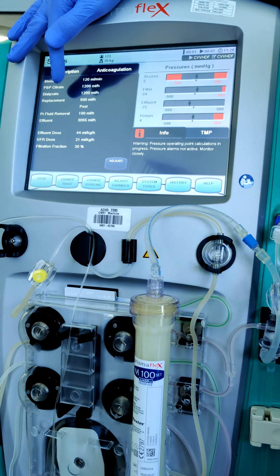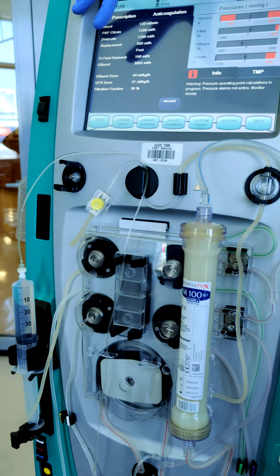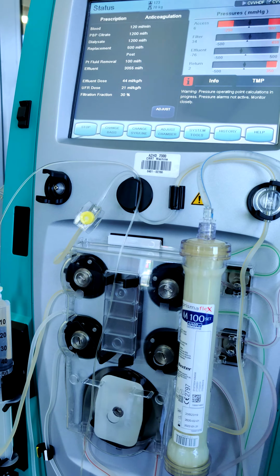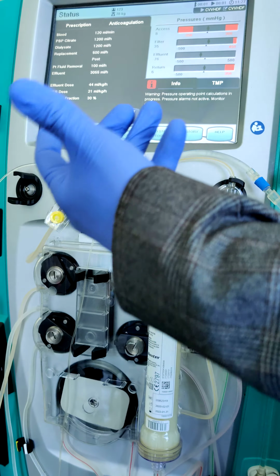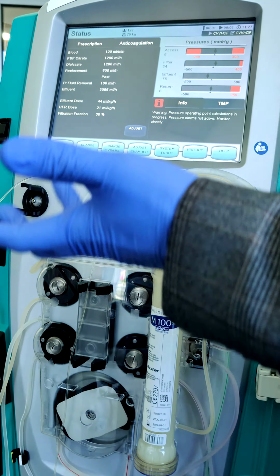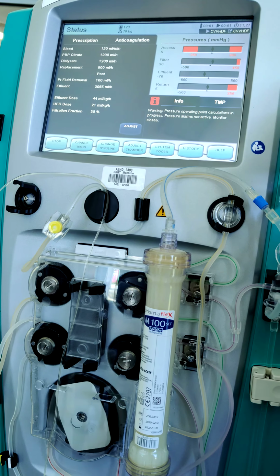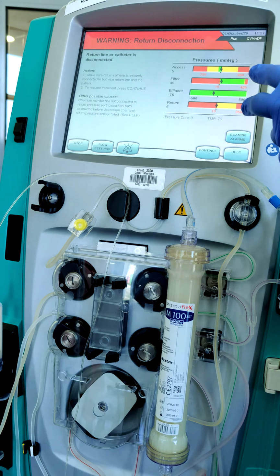The dialysate is calcium free, but the replacement is with calcium, with other composition. So if I'm increasing the replacement, that means I'm increasing the calcium. If you decrease the dialysate, you will decrease the bicarbonate, and the patient will be more acidotic. So I have to follow this dose. It seems I can't change.